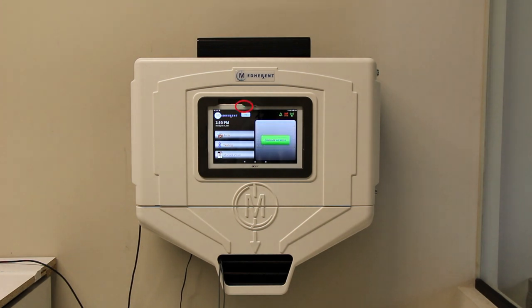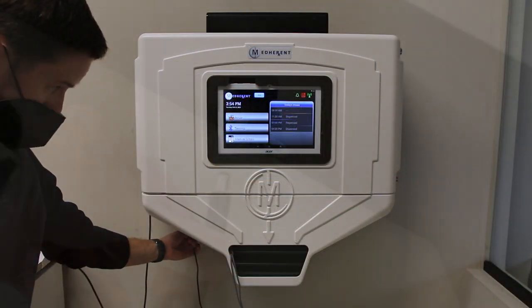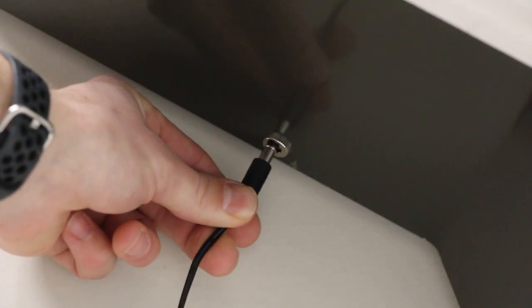When this indicator light is green, the machine is plugged in properly and thus not draining the backup battery. Please make sure that the MedHerent machine remains plugged in at all times. Don't forget to ensure that the cord is plugged into both the wall outlet and the device itself.